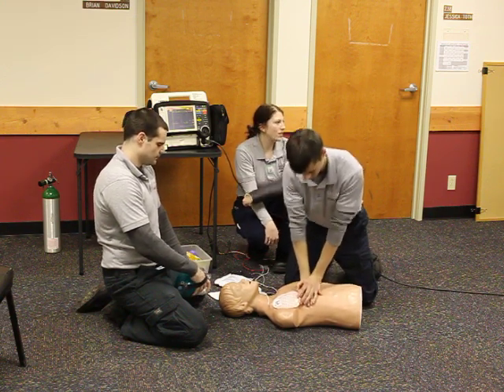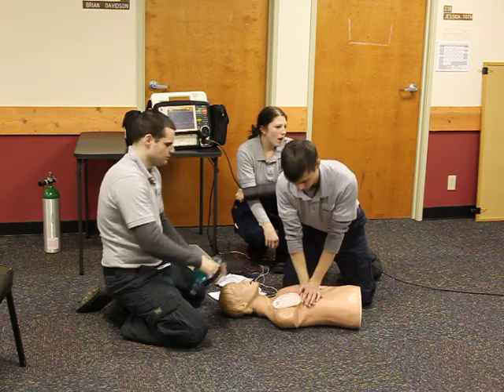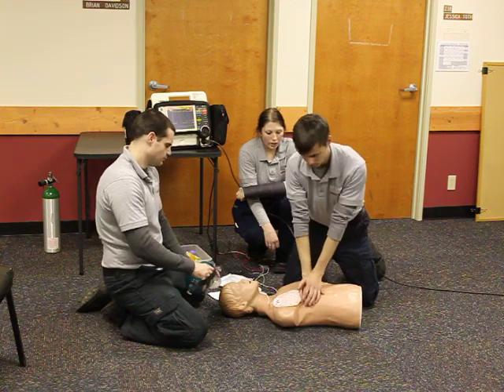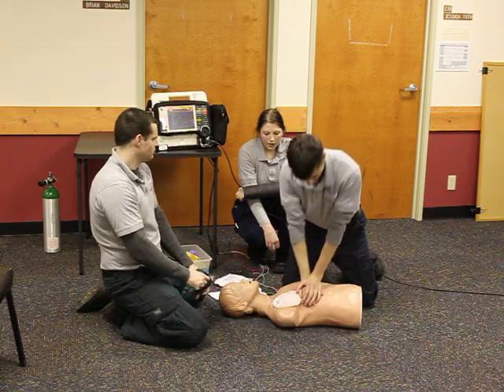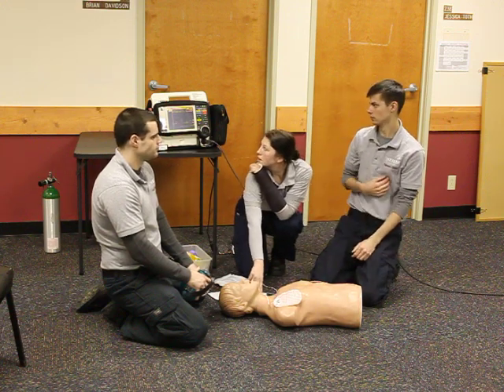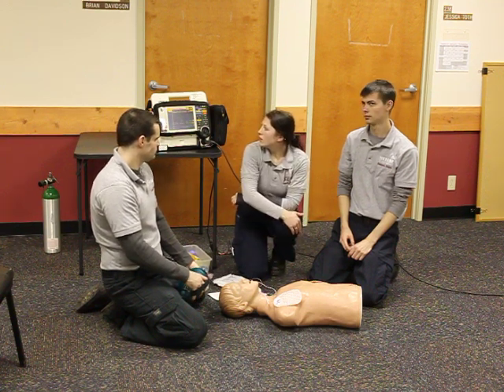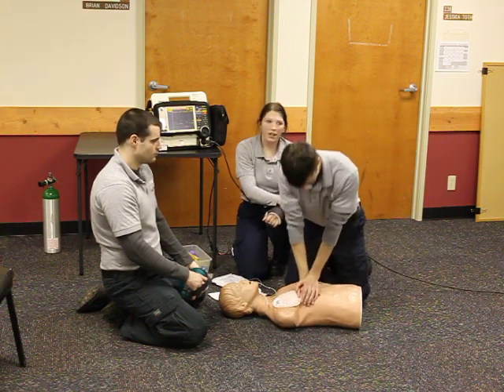At this time, I'd like to rule out my H's and T's. I'm going to consider hypovolemia, hypoxia, hyper or hypokalemia, hypo or hyperglycemia, hydrogen ion acidosis, hypothermia, toxins, tension pneumo, thrombosis, either pulmonary or coronary, trauma, and I think that's it. After 2 minutes, we're going to do another rhythm pulse check. I'm going to feel for a pulse as I look at the monitor. There is no pulse. We're going to continue with CPR. I note sinus tach on the monitor.